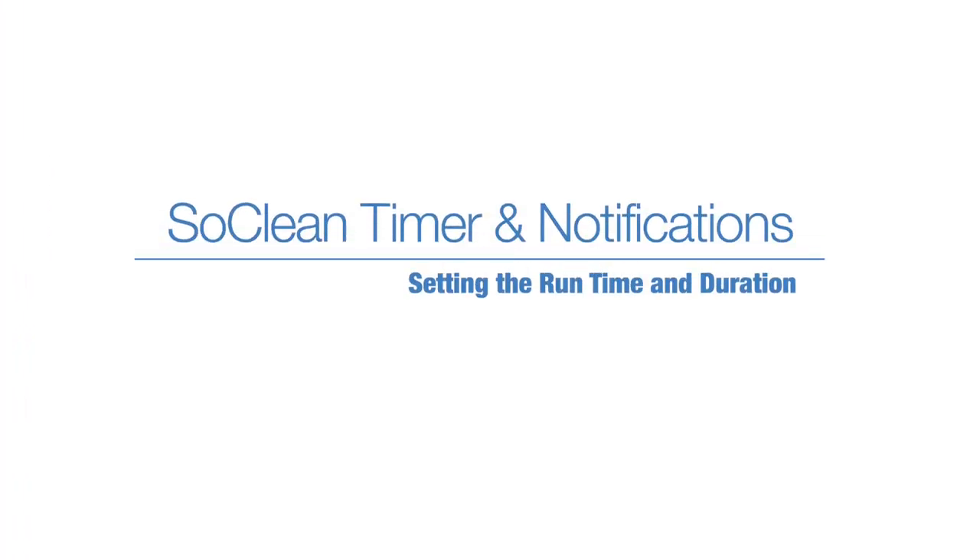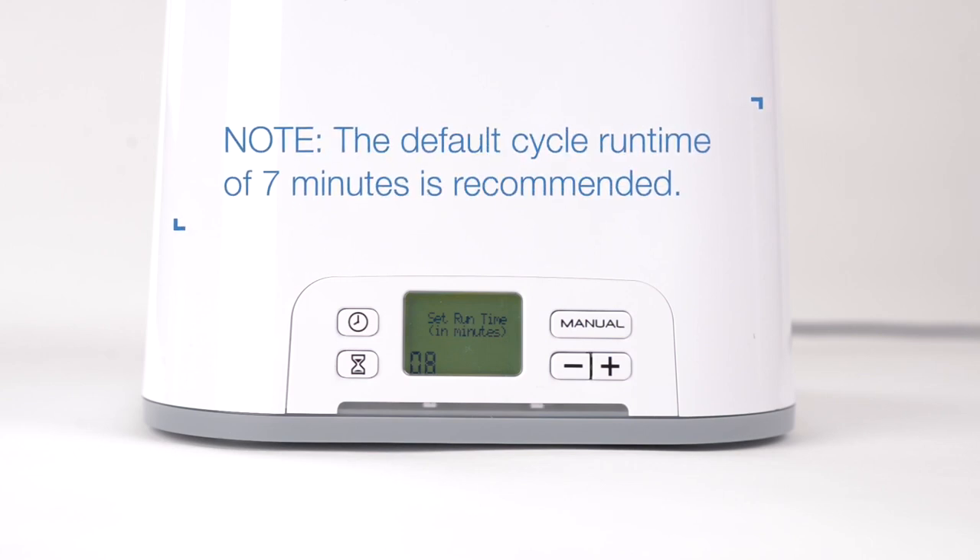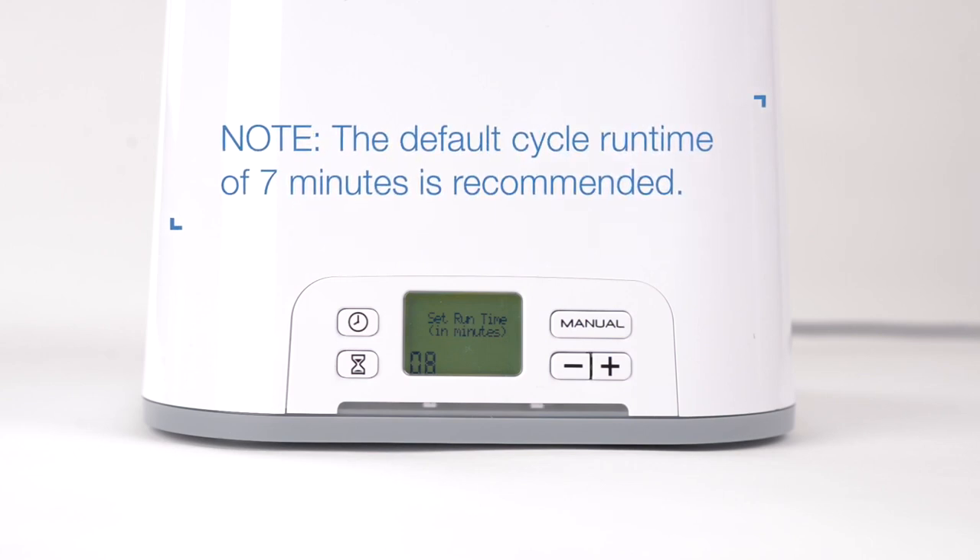To set the cycle run time duration, press the hourglass button. Press the plus or minus button to decrease or increase the number of minutes of your cycle run time. Note: the default cycle run time of 7 minutes is recommended.